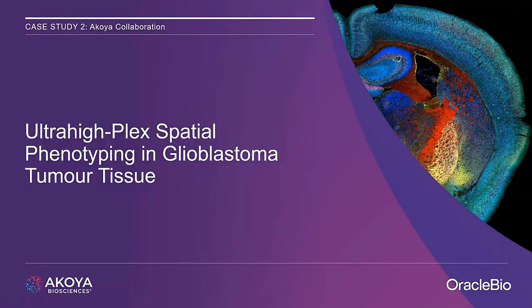Thanks, Gabrielle. The second case study we're covering today is from a recent collaboration with Akoya Biosciences. We received 2 mouse samples. One was healthy brain tissue and the other was a glioblastoma brain tissue. They were both stained with a multiplex immunofluorescence panel, which we used to perform spatial phenotyping.